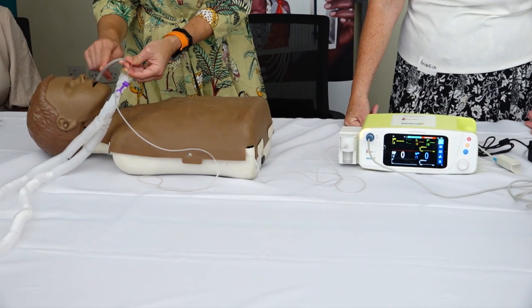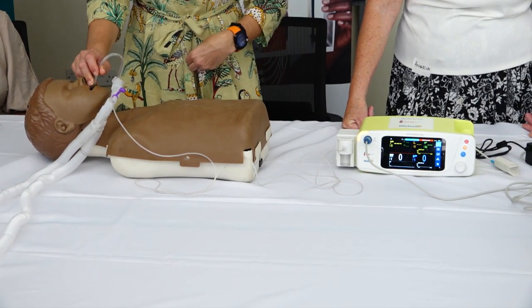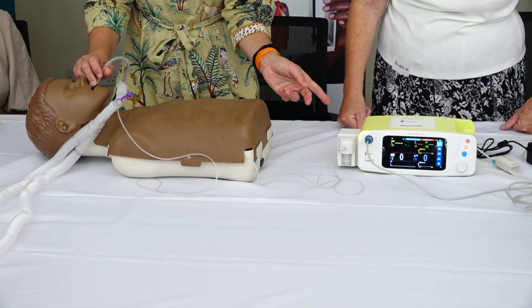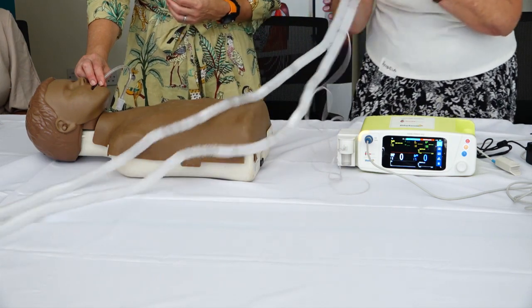If by chance this tube is in the wrong place and ends up in the tube that goes to your stomach or the esophagus, then there'll be no carbon dioxide in the tube, and so you won't get a tracing or a number. So you can very quickly recognize that.